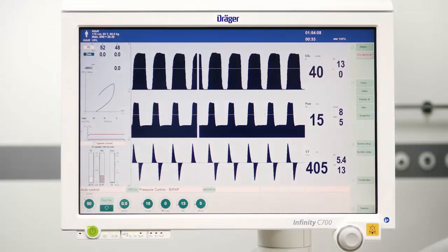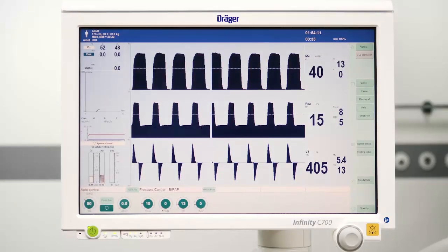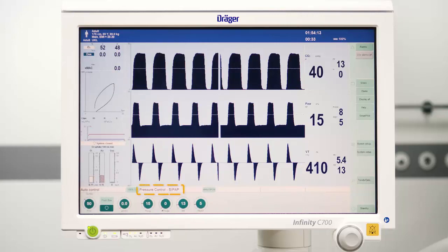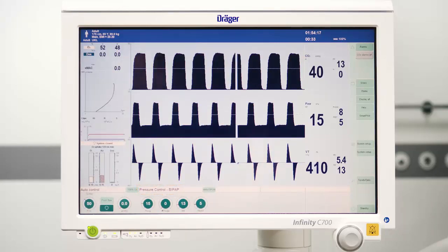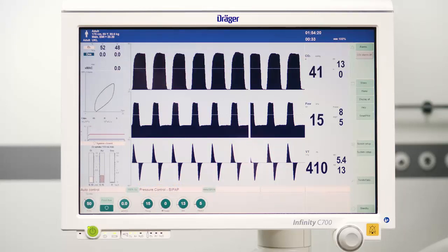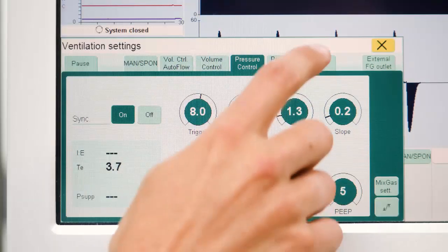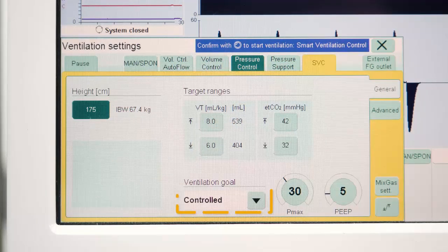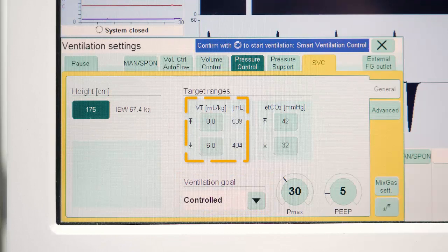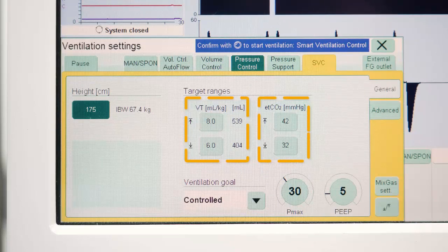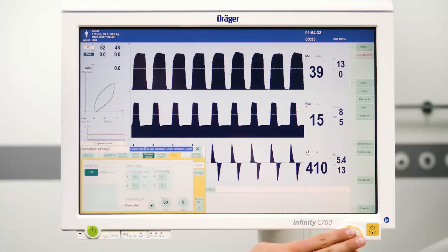You can start Smart Ventilation Control at any point of the operation. In this example, we are in Pressure Control Ventilation. All you have to do is: open the Smart Ventilation Control mode, select your ventilation goal — for example, controlled — and check your target ranges of tidal volume and end-tidal carbon dioxide, and finally confirm the ventilation on the rotary knob.